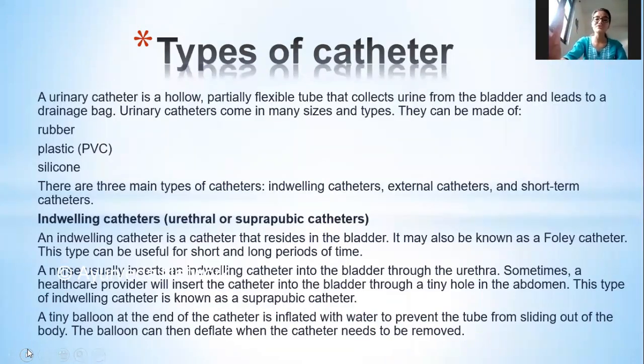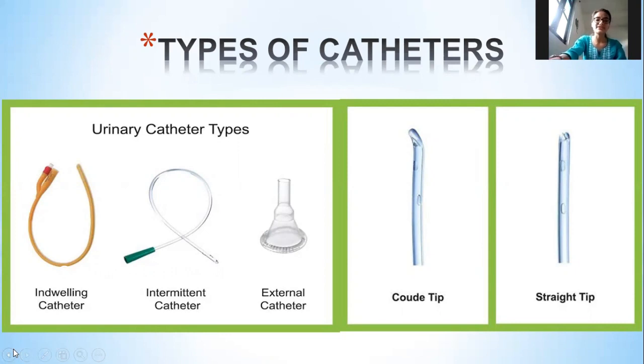These are a few materials of catheters, and now we'll discuss the types of catheter. But before that, we'll also discuss the size of the catheter. That will also come in a later slide, but we will discuss general sizes of catheter we have, right? In the next few slides, we are going to see a table of various color-coded catheters. But when you are going to decide on a catheter, generally for an adult male, you will take a 16 to 18 French sized catheter, right?